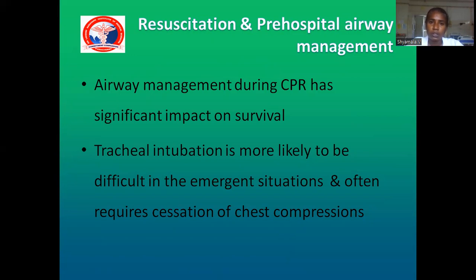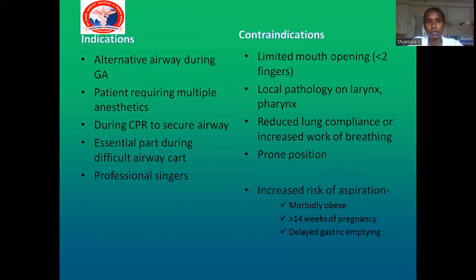So you have to maintain the airway during CPR. In the pre-hospital area, where you can't get a laryngoscope or endotracheal tube or even a trained and skilled person, and tracheal intubation is difficult, you can use this LMA.